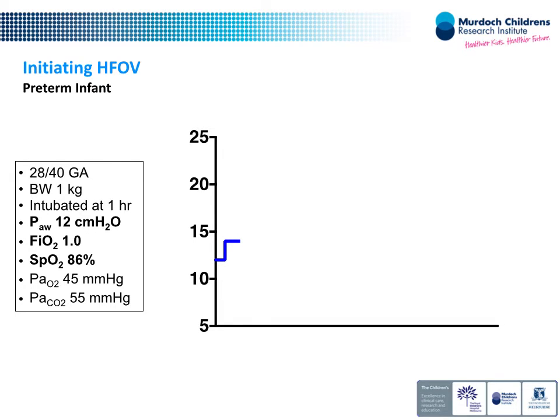If the baby is poorly ventilated and atelectatic or over-distended, there's enough information at the bedside that will help you know that. And the X-ray is a confirmatory tool and a diagnostic tool for other pathologies, in my view. What do you think? I'm going to keep asking the expert.